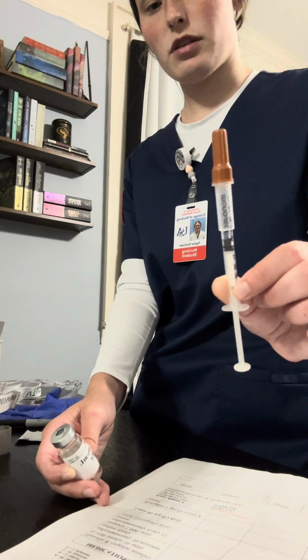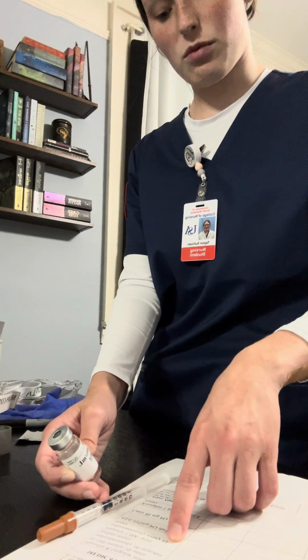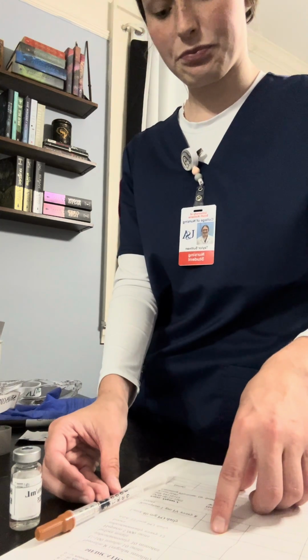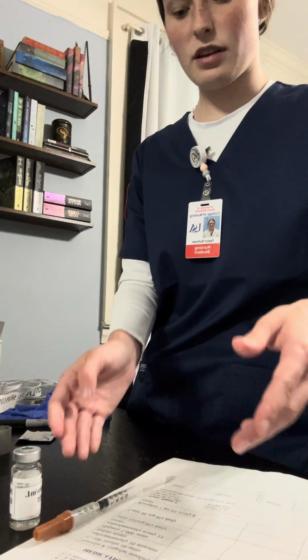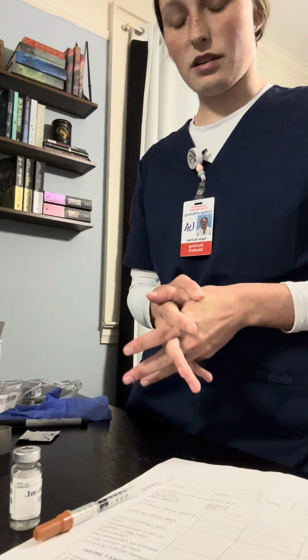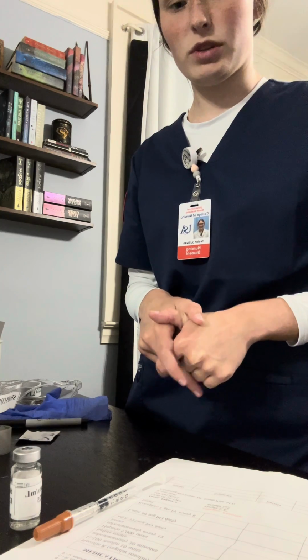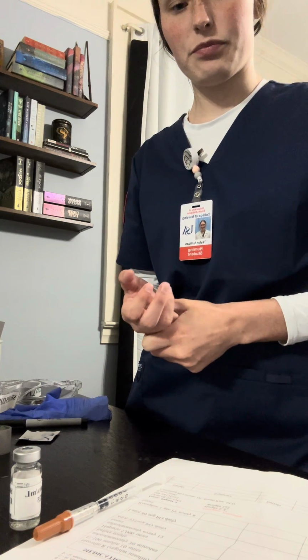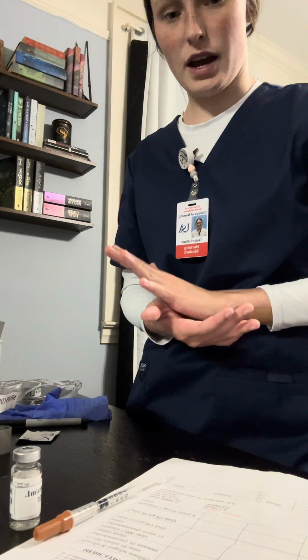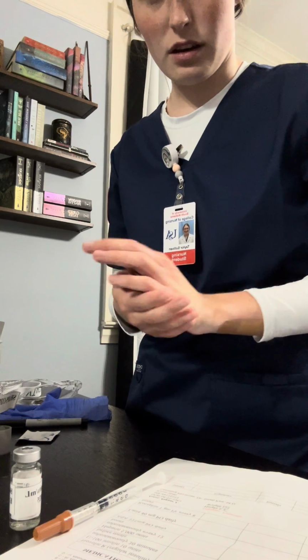I've got my tuberculin syringe. Time is every 12 hours, and he is ready for that. Indication: Mr. Jones is getting heparin. It is an anticoagulant, and it helps the blood not form any clots. And then documentation.